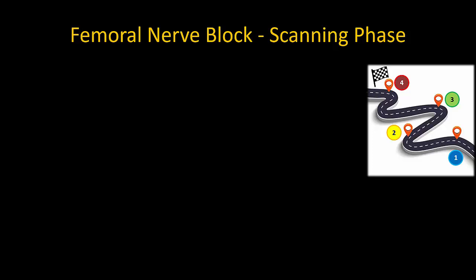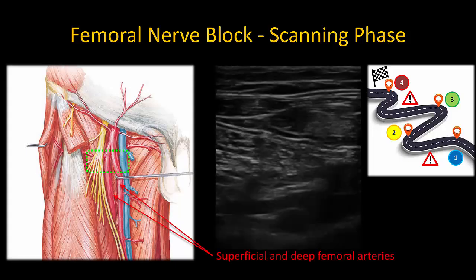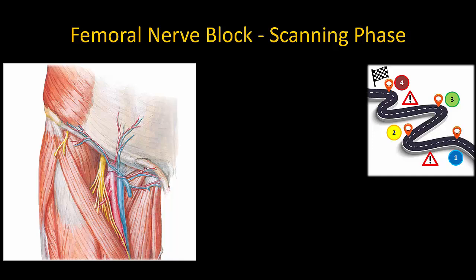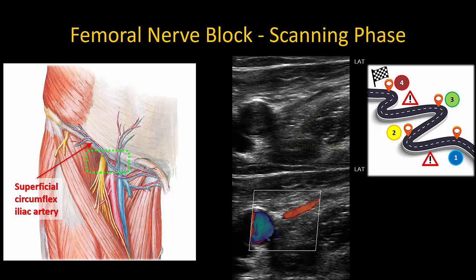There are a couple of vascular structures to watch out for. If the probe position is too caudal, the femoral artery will have branched, but you may also see the lateral circumflex femoral artery lying deep to the femoral nerve. If the probe is too cranial, on the other hand, you may see the superficial circumflex iliac artery and vein as a hypoechoic, pulsatile, or compressible structure lying superficial to the femoral nerve.